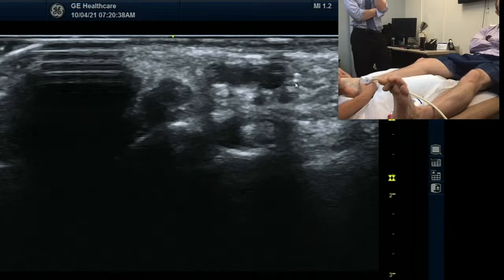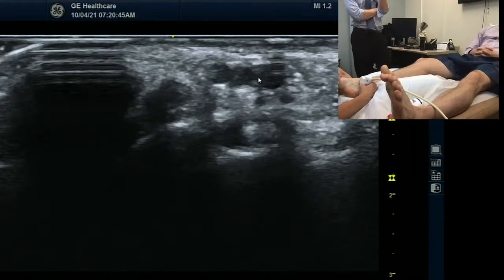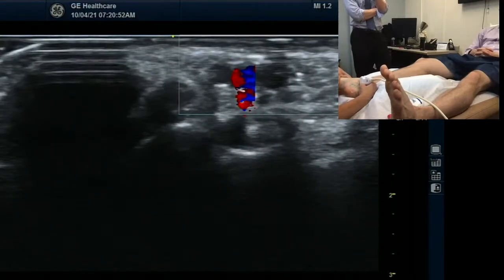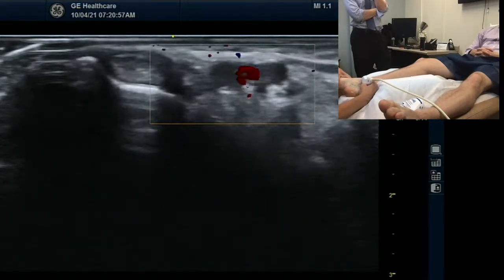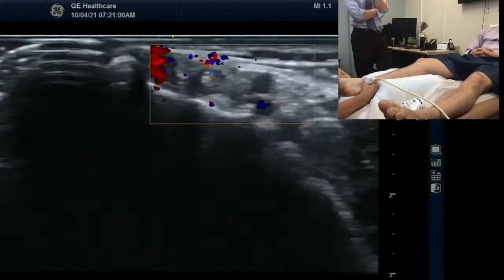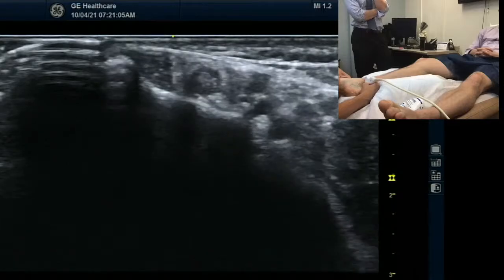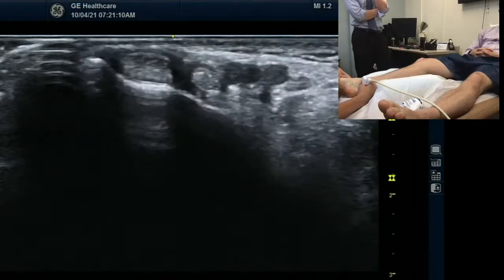Are you moving? Nope, I'm staying still. Looks like there are three vessels. You can turn on the Doppler if you want, but yes, one is already a vein. Can you go a little more proximal? Like a couple centimeters? See if they're coming together? Can you take off the Doppler? Now it's a little more distal. Is that where it's — yeah. It's starting to split — it's starting to split, right?